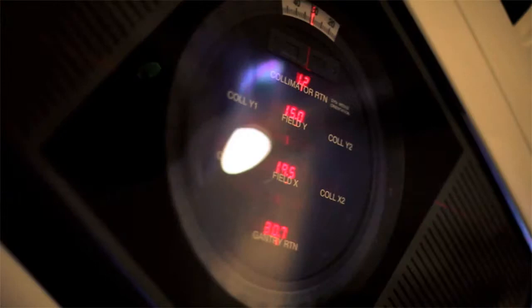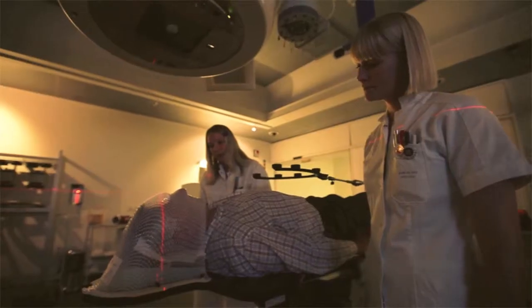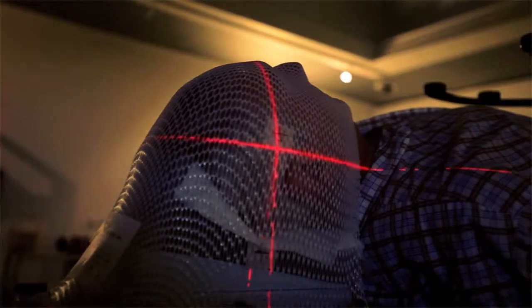At the moment we have five Varian LINACs all equipped with ExacTrac. Using the two stereoscopic x-ray images, you can place the patient with sub-millimeter accuracy.